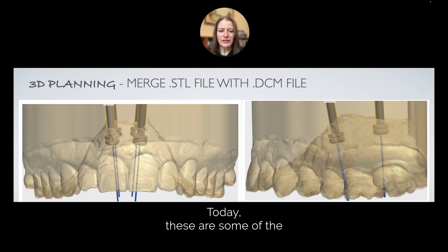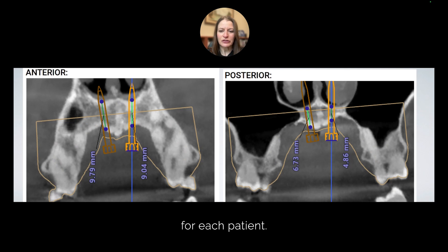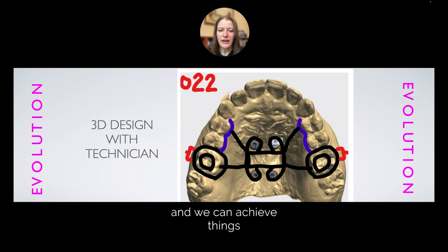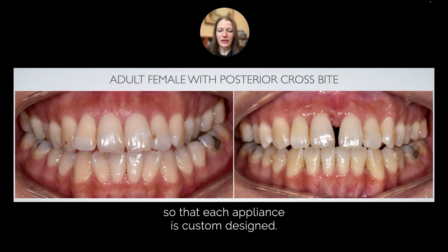Today, these are some of the screenshots of a custom MARPI design. We integrate the 3D x-ray with the digital file for each patient. We custom design where each TAD goes in order to engage the most available bone. This helps dramatically increase our predictability, and we can achieve things that we couldn't achieve in the past. We 3D plan our appliance design with our technician so that each appliance is custom designed.